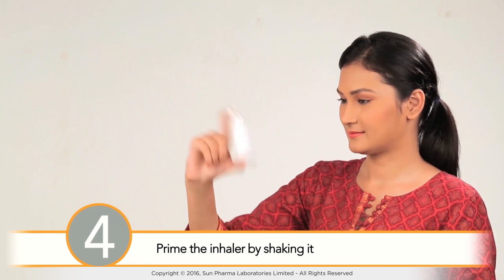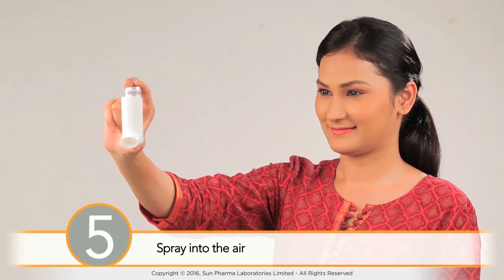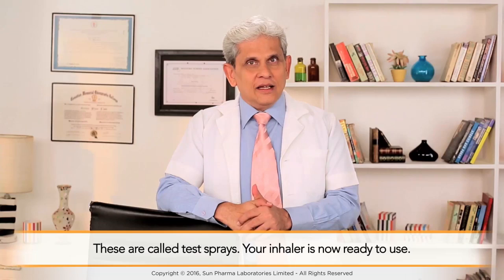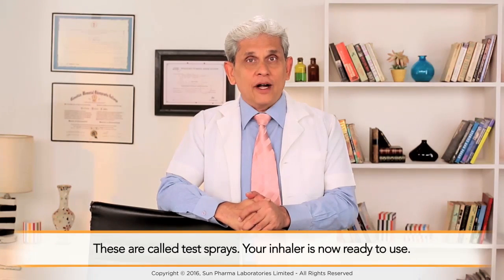You can then prime the inhaler by shaking it and spraying it into the air away from your face. These are called test sprays. Your inhaler is now ready to use.